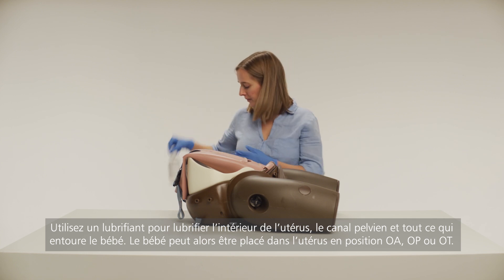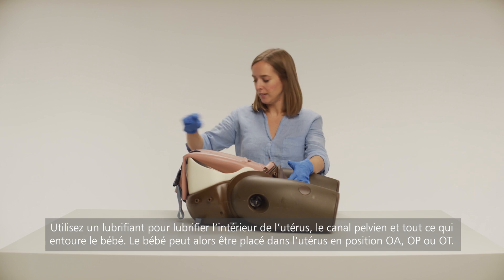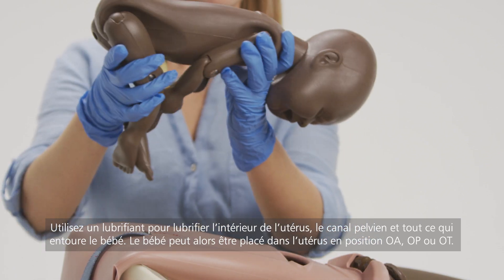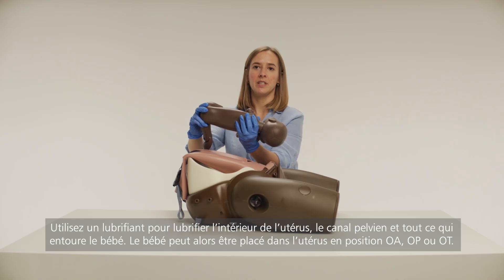Use lubrication to lubricate the inside of the uterus, birth canal, and all over the baby. The baby can then be placed inside the uterus in the O-A, the O-P, or the O-T position.